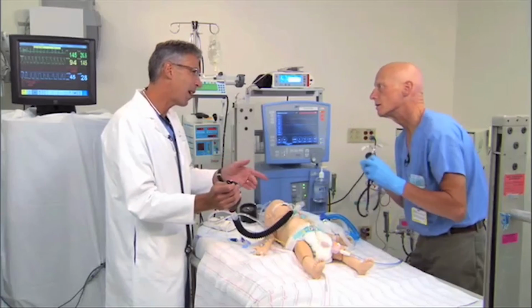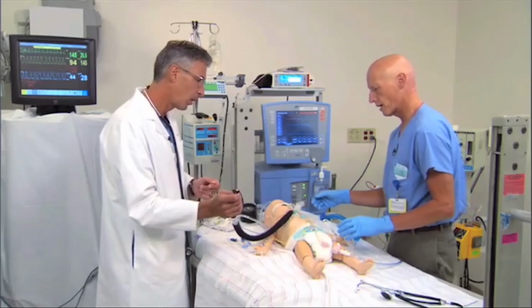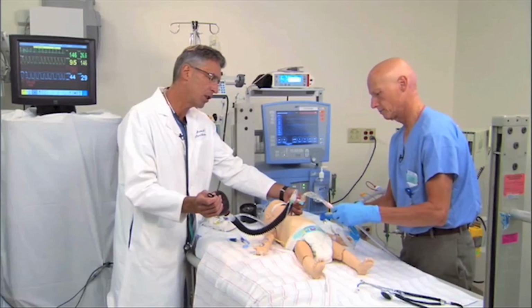Now, Barry, by my exam, I think she needs to be suctioned before we proceed. Do you agree? I agree. I hear some rhonchi as well as crackles, John. Okay, so let's go ahead and do that. We'll advance our inline suctioning system.